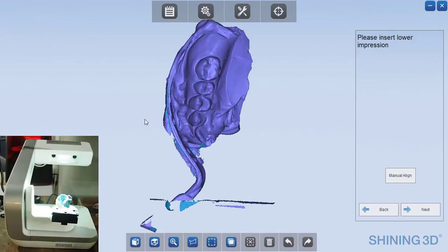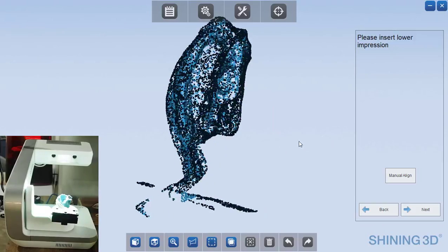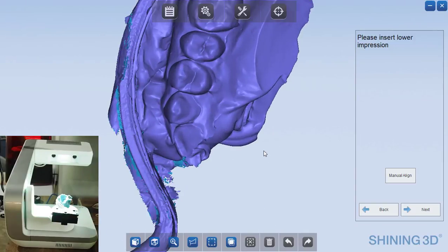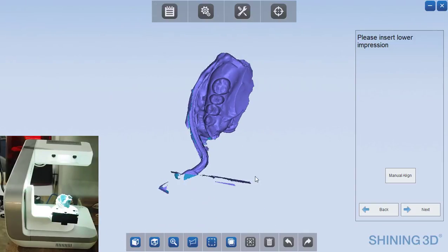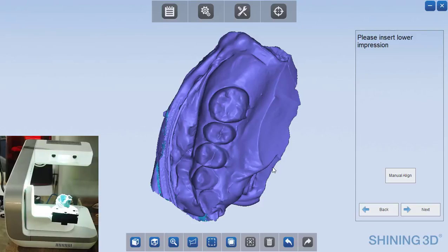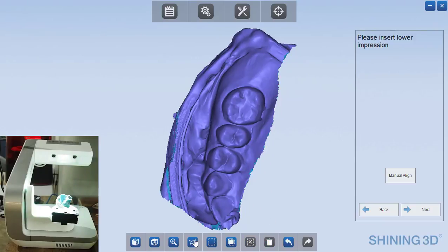And so you see the software now stitches those based on the common data between them. And at this point you would probably want to trim your data up and so we can do that by pushing the shift key and circling that data. If you just push delete, it will get rid of it. Now I can do that again. Get rid of some of the excess areas over here where you wouldn't be able to see in.